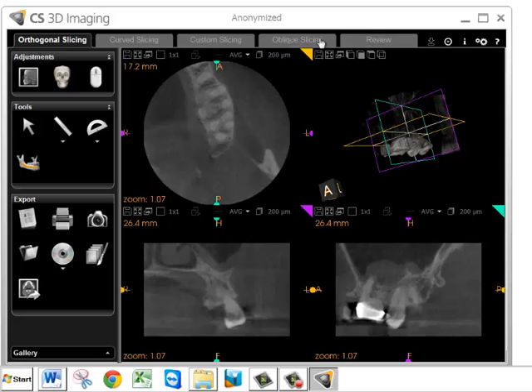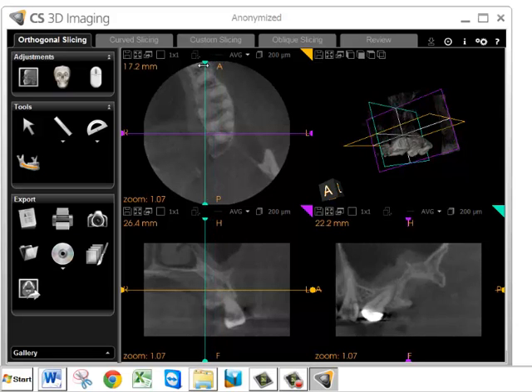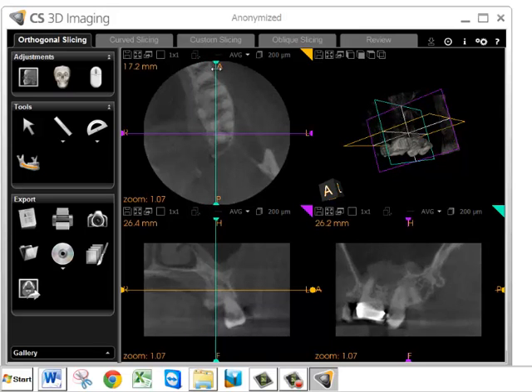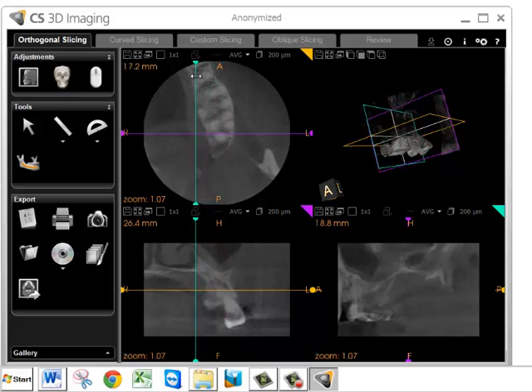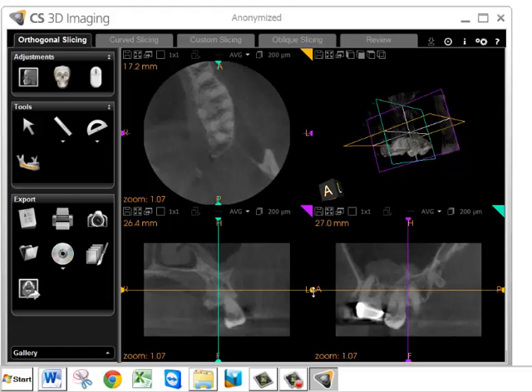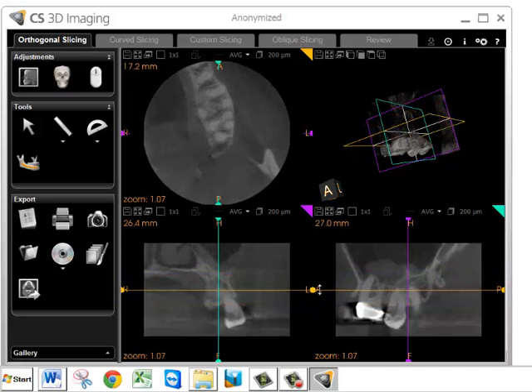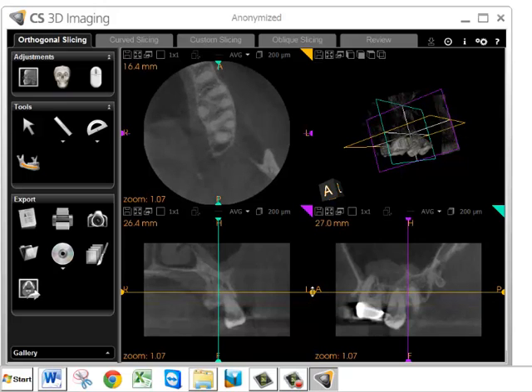You'll notice across the top there are a number of tabs, and it opens in the orthogonal slice. To move each one of these slices, simply put the cursor over the semicircle in the color-coded window, then hold down the left mouse button and drag that slice back and forth. You can see in the lower right-hand corner that dragging moves the slice back and forth through the volume.